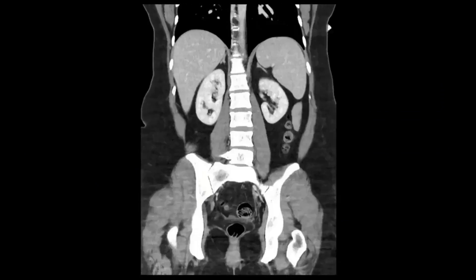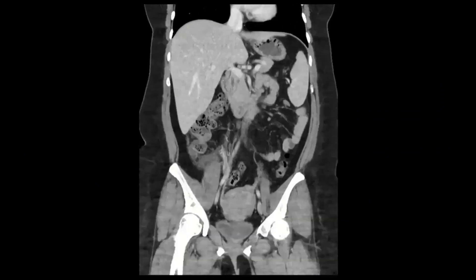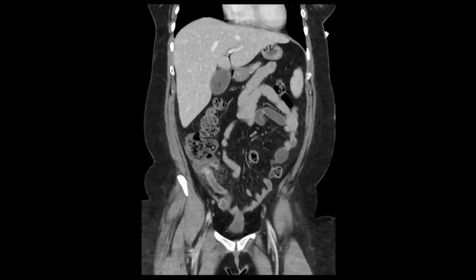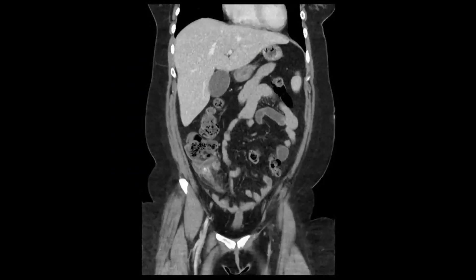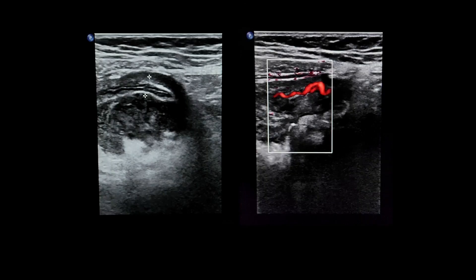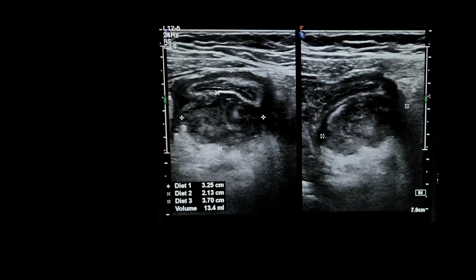On CT you can see a dilated appendix with surrounding fat stranding. In this ultrasound case we can see the dilated appendix, surrounding hypoechoic material, and inflamed fat below that.